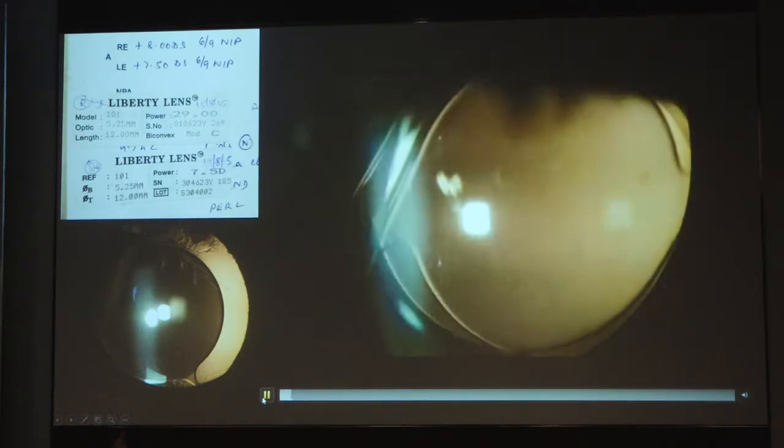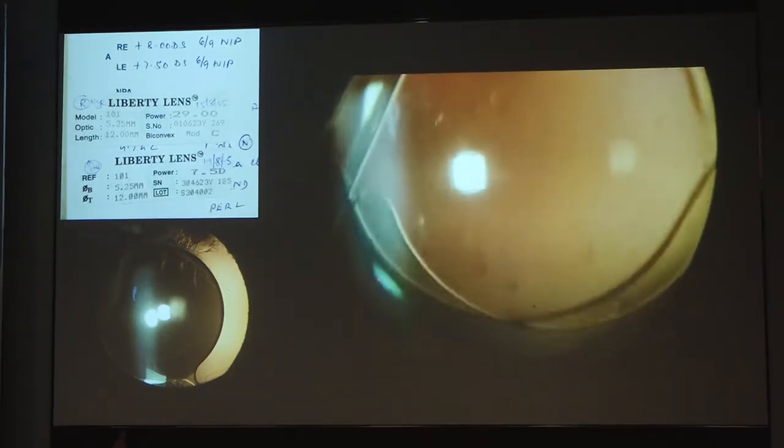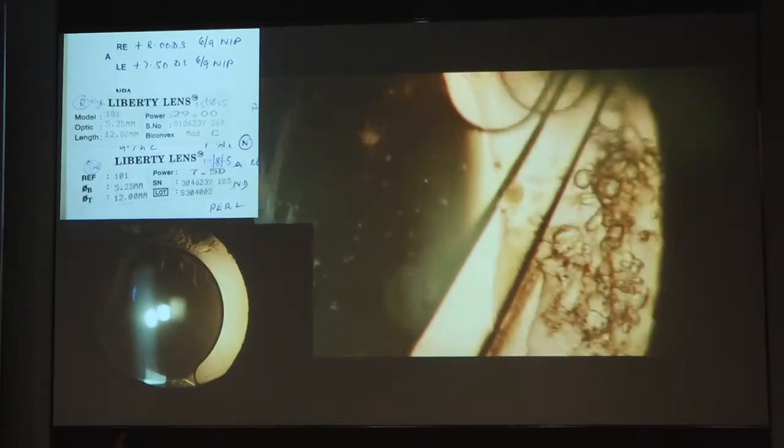So here is one more patient who had surgery done several years ago. I think it was about 15 years ago, and she had a +8 pre-op, and the initial power that I put was not sufficient, so I put a piggyback lens in the eye. She came for a review 2 or 3 weeks ago, so I took this movie, and these are 2 PMMA lenses from Appasamy Associates, and she's quite happy.